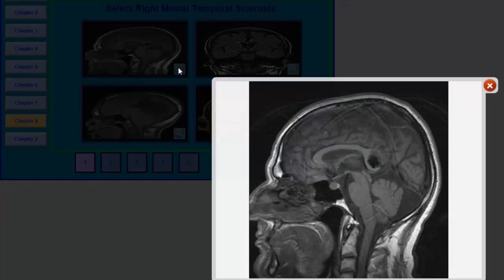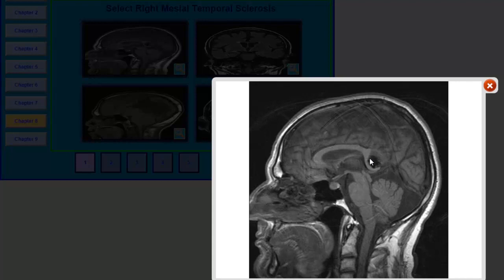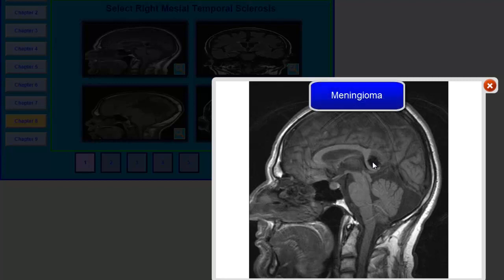Let's start with this first image. This is a mid-sagittal section. You are looking at the corpus callosum, the midbrain, pons, medulla, the cerebellum, and the cerebral hemispheres. What you see here is a rounded oval-shaped lesion pressing on the splenium of the corpus callosum. This is not mesial temporal sclerosis — this is basically a meningioma, which you can confirm after doing a gadolinium-enhanced image.